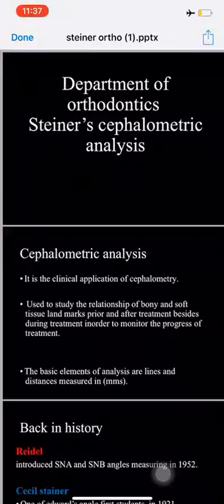محاضرتنا اليوم Steiner Cephalometrics Analysis. Cephalometric analysis is the clinical application of cephalometry. This is used to study the relationship of bony and soft tissue landmarks, prior to, during, and after treatment, in order to monitor the progress of a treatment.